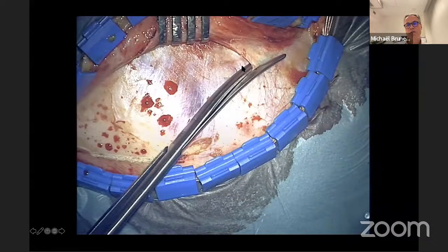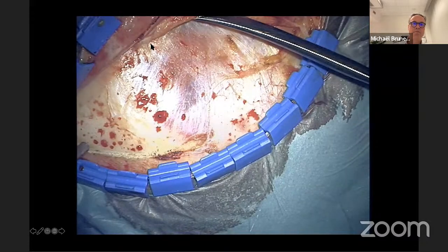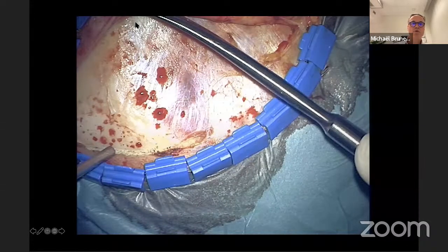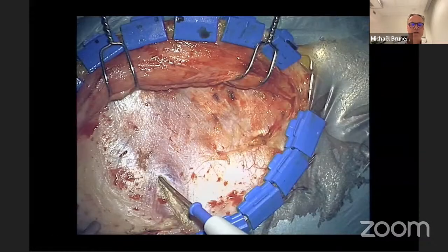Then, caudally, you will gently incise the aponeurosis with your scissors, again in a posterior direction. Then the fat pad is elevated in one piece very easily. Here you expose the orbital rim, and then very quickly the fat pad is mobilized anteriorly. It's a question of seconds to do that in one block, and the facial nerve is protected.